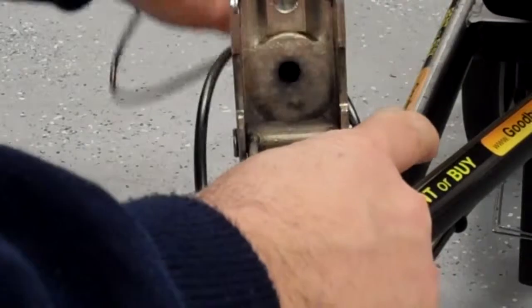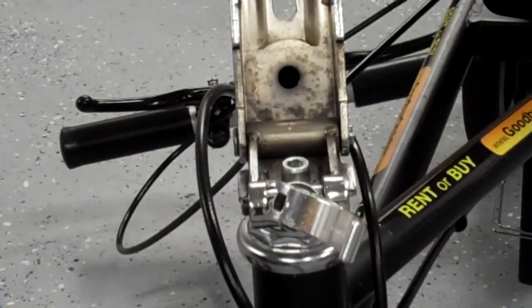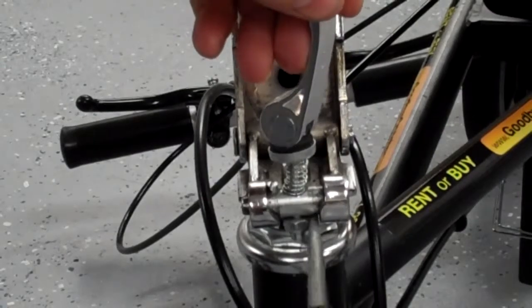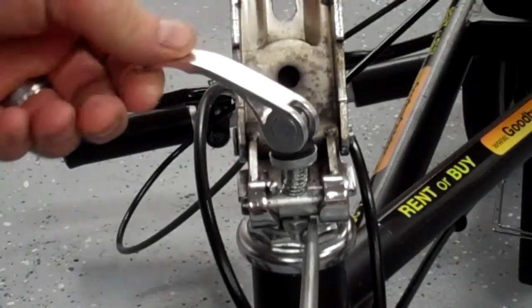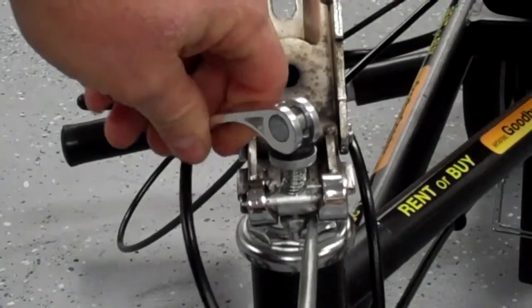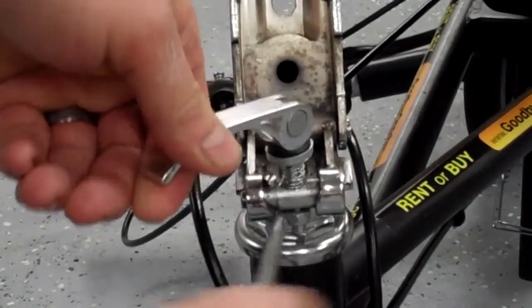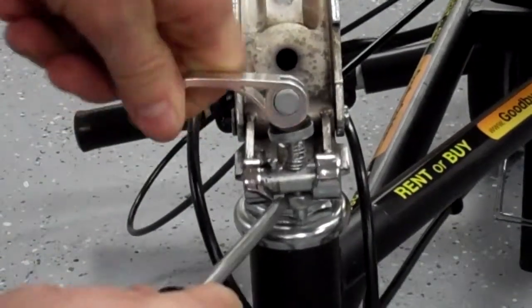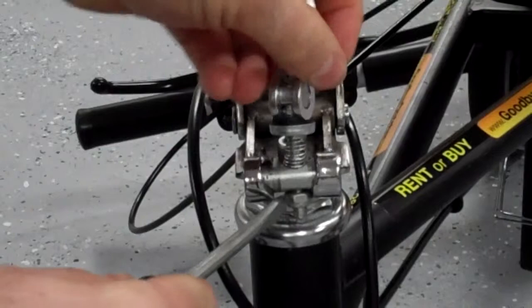Easiest way to do this is fold the mast down, then take a knife or a screwdriver to hold the nut right there. And to make it tighter, just turn in the clockwise or right direction. That'll make it tighter.